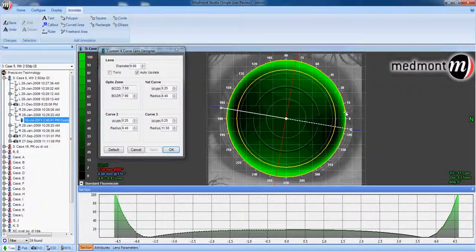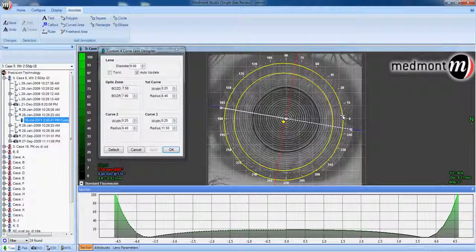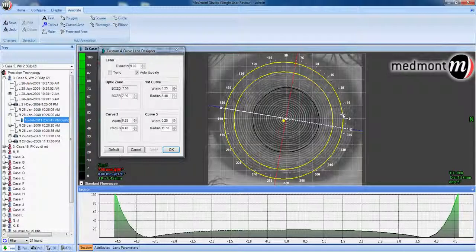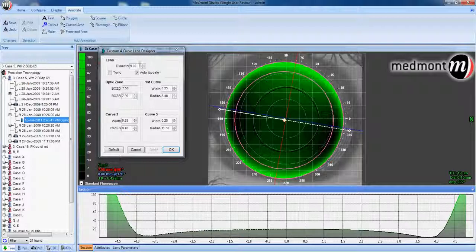Next, let's pick up the contact lens and place it somewhere near the geometric center. So ignore the placido and center the contact lens in relationship with the sclera. So looking at the white of the eye around here and placing your contact lens as it appears centered, not to the placido rings that you can see just outside of the lens, but more so to the iris or limbus.